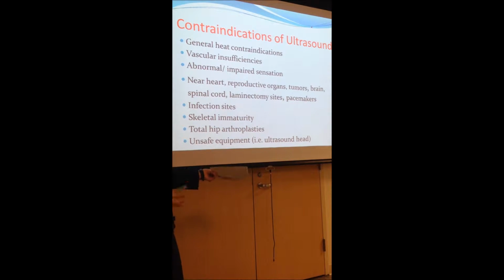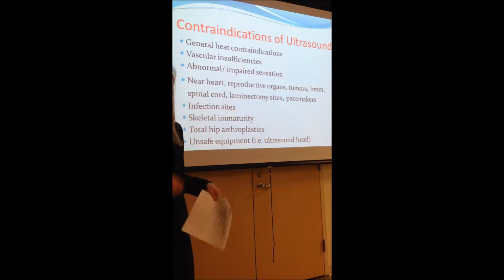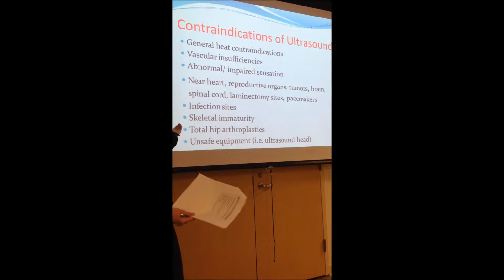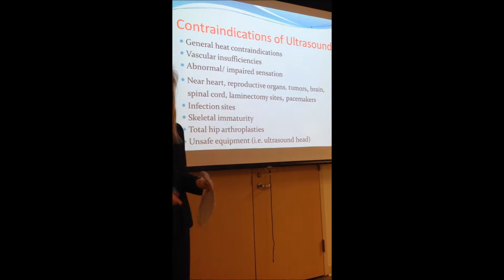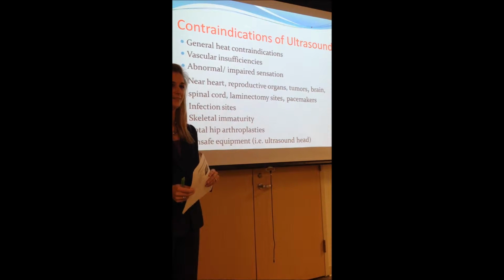Pacemakers. It doesn't mean someone with a pacemaker can't have ultrasound applied to them, it just means it can't be over the pacemaker, so it can be at a more distal site. Infections, obviously we don't want to spread them. Skeletal immaturity, total hip, not a good idea. And any sort of unsafe equipment. If your ultrasound head isn't working correctly or there's a hot spot, it's a good idea to get that replaced.